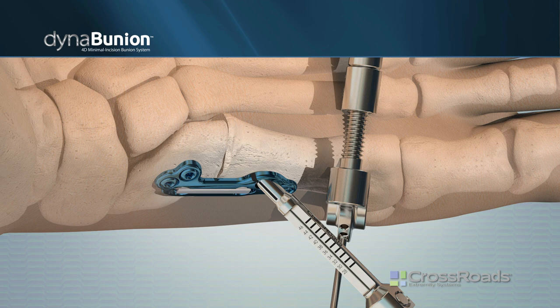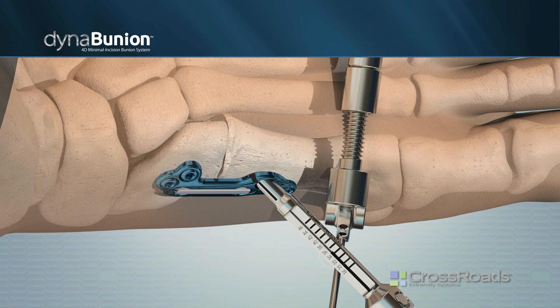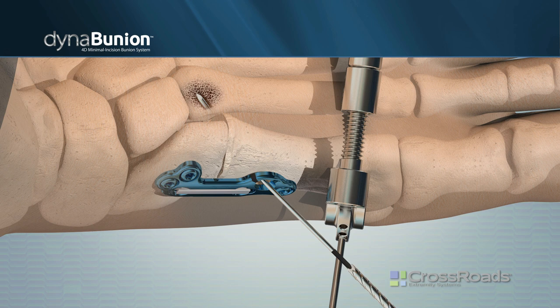Examine the window of the wire guide to determine which bolt size will be needed. Use the anti-drift bolt cannulated reamer to drill over the wire. Ensure the medial cortex of the second metatarsal is penetrated.